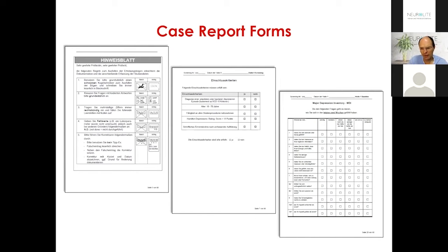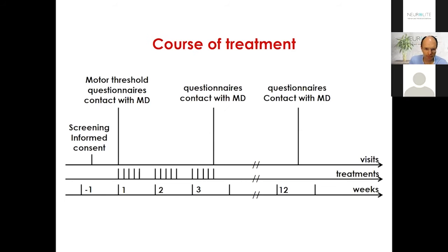For us in Regensburg, we decided to have a very clear documentation of the treatment. We have case report forms for this, typically used in clinical studies. We also use them for our regular TMS treatment, something we established only recently, because we really want to evaluate every single patient. So every patient has a case report form where all the documentation concerning TMS treatment is done.